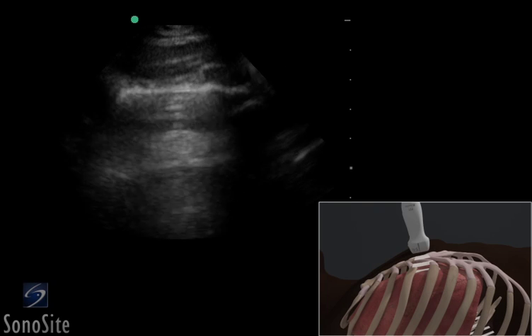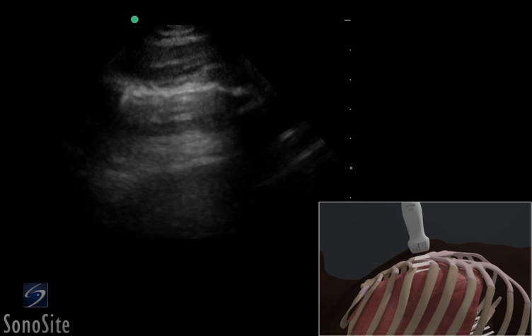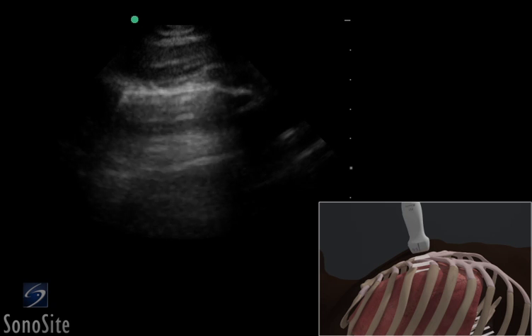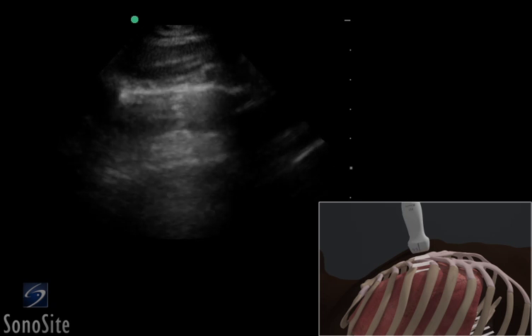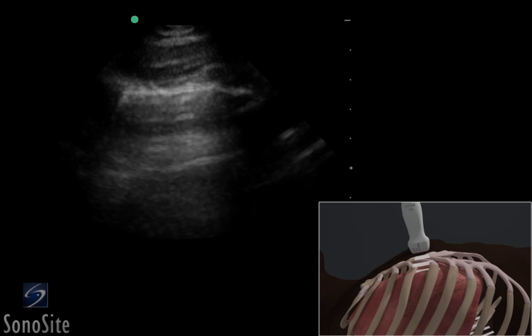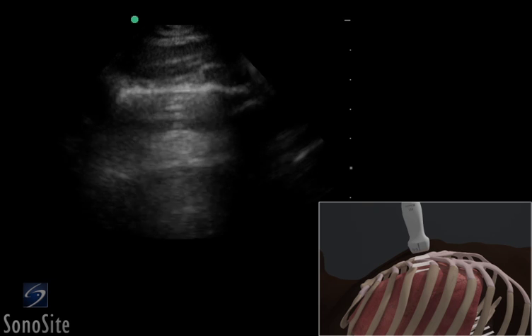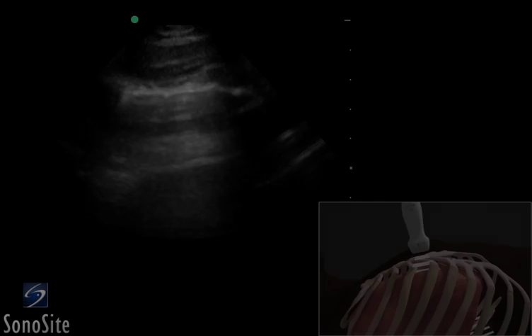A phased array transducer with a lung exam type is used to evaluate lung sliding. The anterior, lateral, and posterior zones of the chest wall should be evaluated.